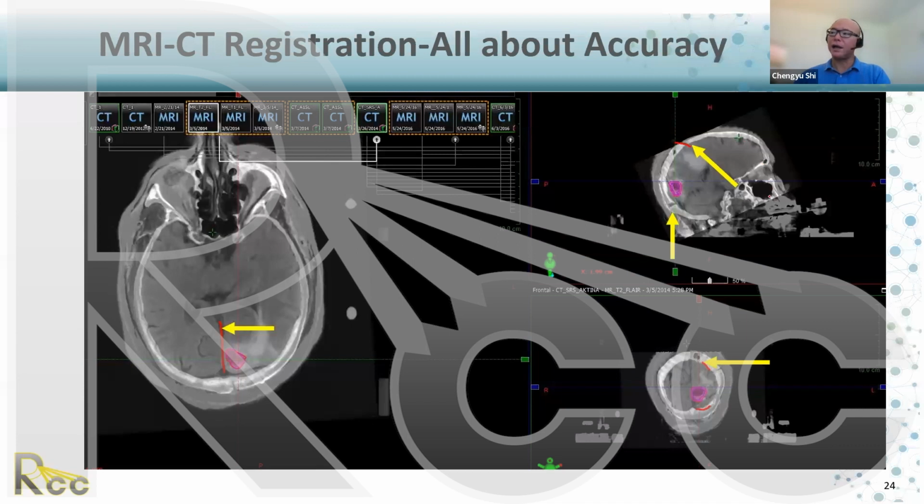When you do the registration, you can drag this direction and that direction to rotate it. And it's very easy to mismatch because the skull is like a ball, and how you match a ball, point by point, it usually slides around. So that's why you make sure that you check those feature points are good to match each other. You know you are not rotated too much.